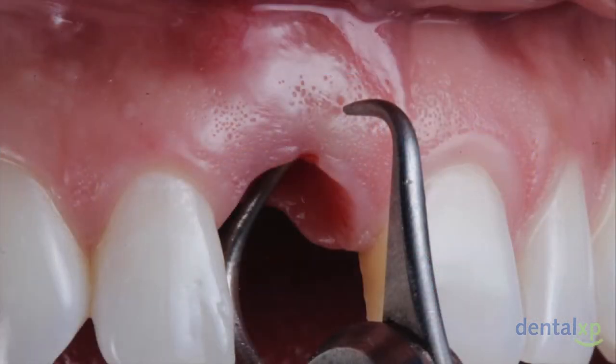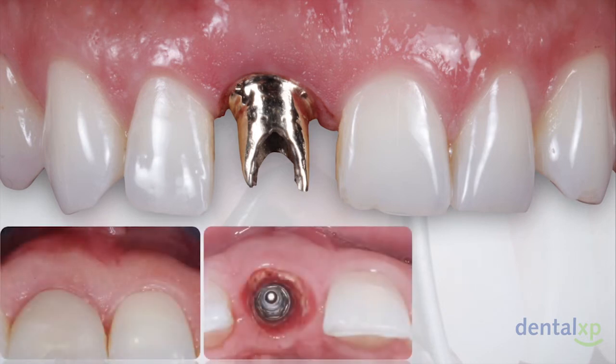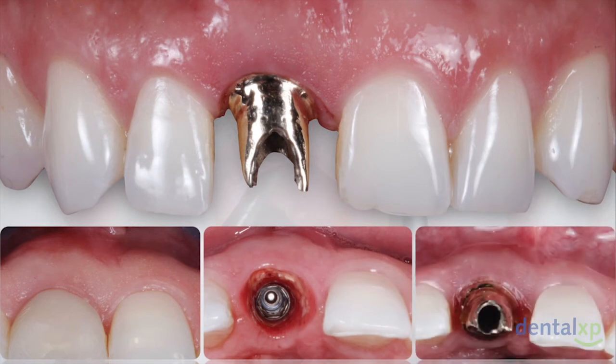And an additional advantage of enhancing tissue thickness in a thin biotype case is that it really gives the restorative dentist flexibility in terms of materials for their abutment selection without having to worry about any show-through of the restorative components through the tissue. Also, if we take a look at the occlusal views, you can appreciate that we're able to achieve an increased amount of tissue volume, which would aid us in adequate long-term marginal tissue stability around those implants. So preventive or preemptive augmentation in high-risk cases may have significant benefits for the final aesthetic outcome of the case.